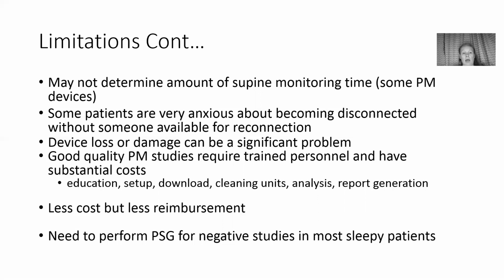Some of the costs come into play with paying for the tech to educate the patient correctly and thoroughly, setting up equipment, downloading it, cleaning the units, analyzing and preparing the reports. Overall, the cost of home monitoring is less, but they also get less reimbursement. The need to perform in-lab sleep studies for negative studies occurs mostly in sleepy patients.